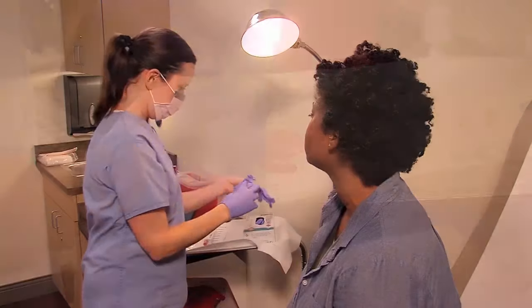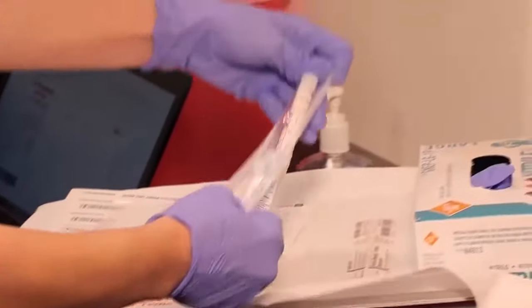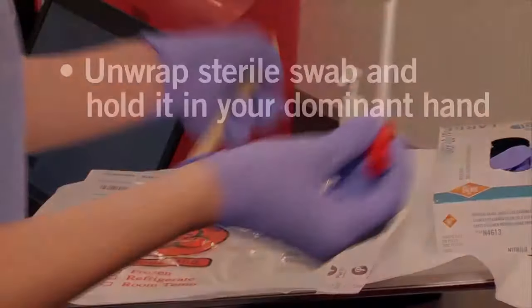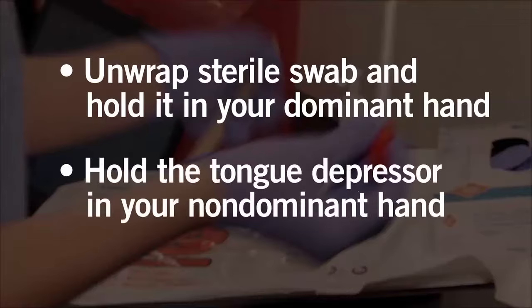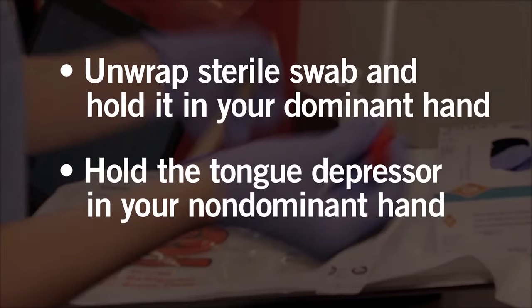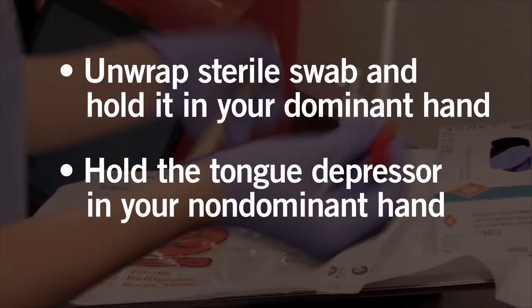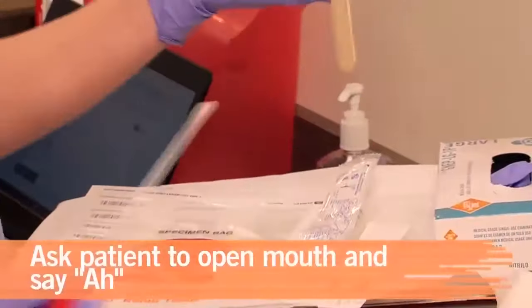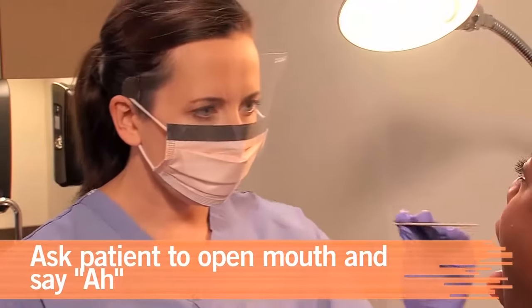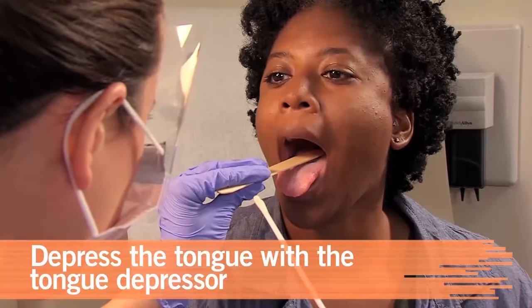Remove the sterile swab from the wrapper and hold it with your dominant hand. Hold the tongue depressor in your non-dominant hand. Ask your patient to open her mouth and say ah. Depress the tongue with the depressor.